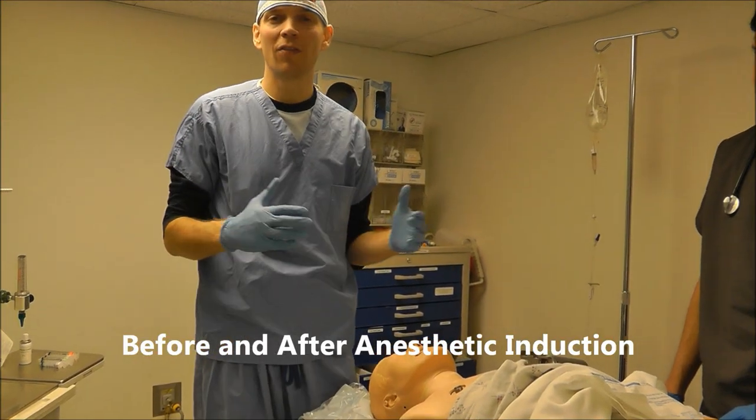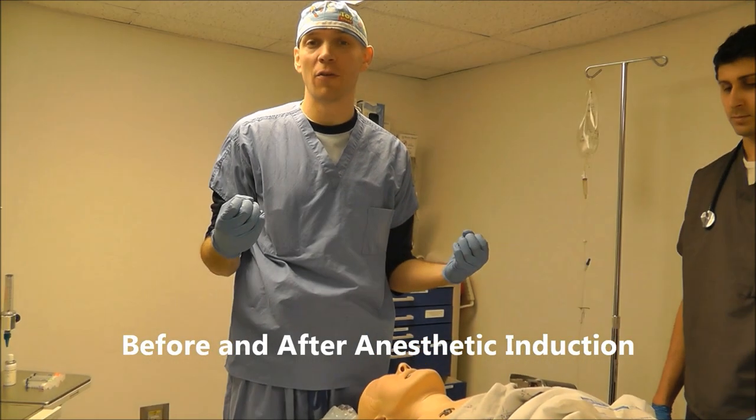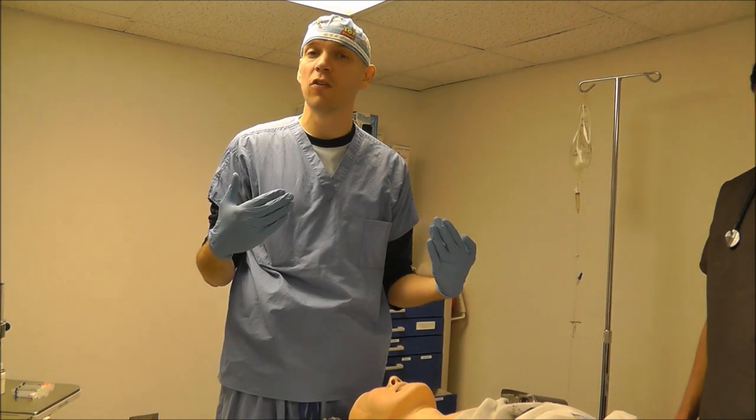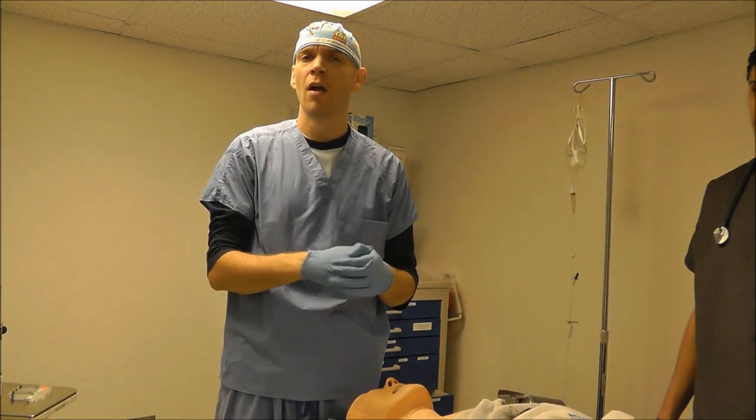We're going to go over the steps of induction for general anesthesia using an endotracheal tube, placing someone on the ventilator.